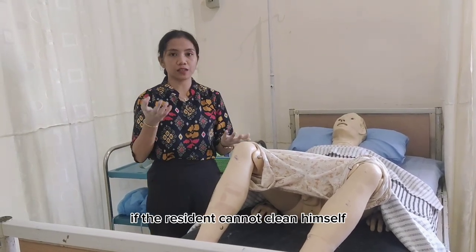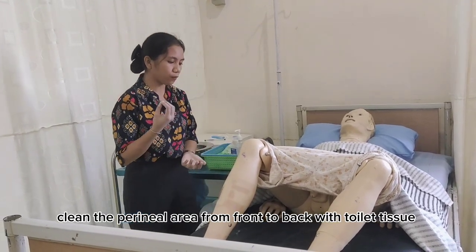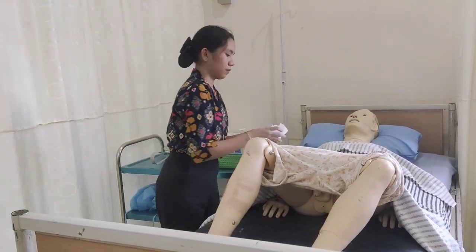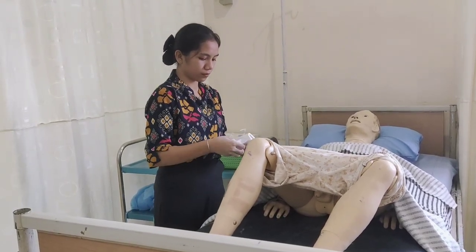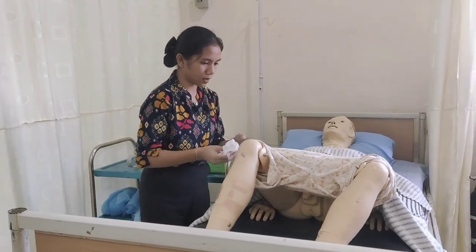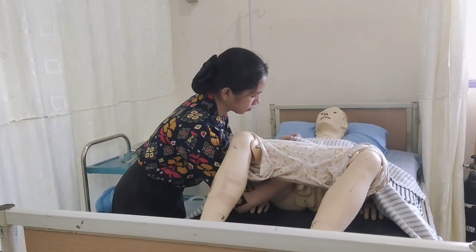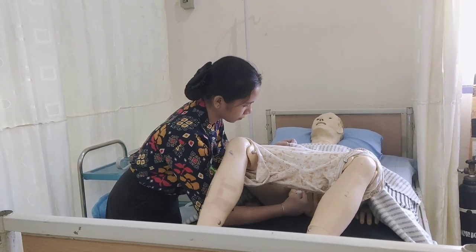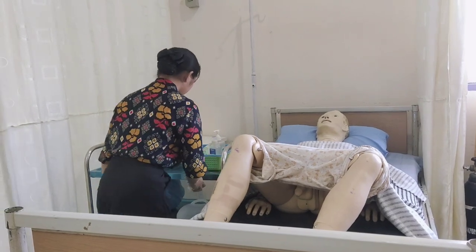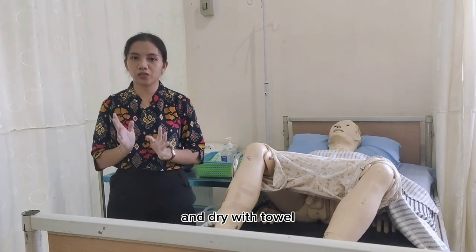If the resident cannot clean himself, clean the perineal area from front to back with toilet paper. Excuse me, sir, I will clean your perineal area. And dry it thoroughly.